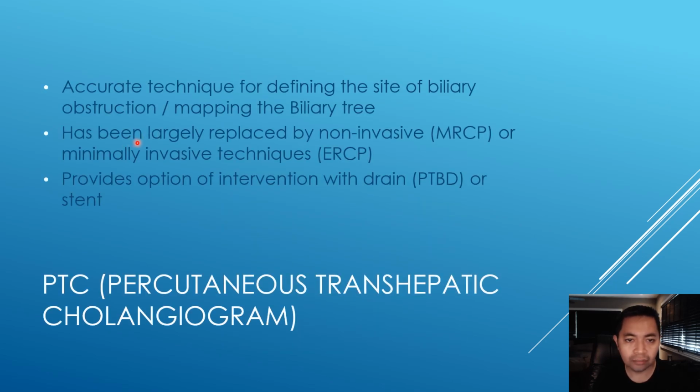But I have not been doing this much recently because of the availability of the MRCP, which basically does the same thing. However, PTC does provide the option to do a PTBD immediately after.